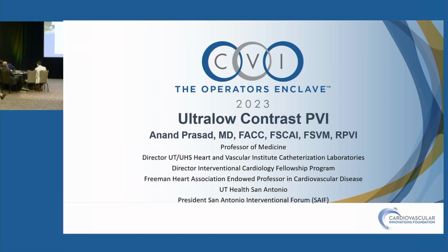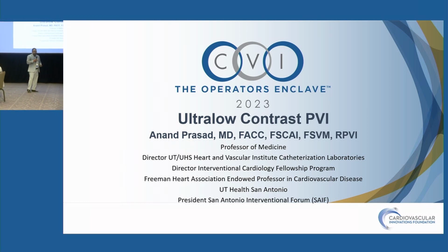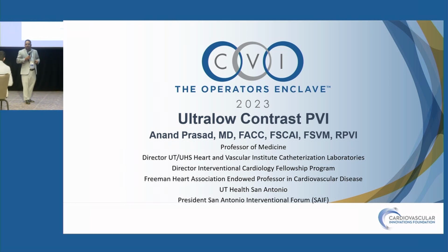The next presentation is ultra-low contrast PVI, and we know that contrast is our enemy. And this is going to be given by Dr. Anand Prasad from UT San Antonio. Thank you, Anand. So hopefully contrast is not the enemy. We'll see that. But what's common in all the cases you're going to see here for the next few days is contrast dye. So learning how to manage contrast is important.